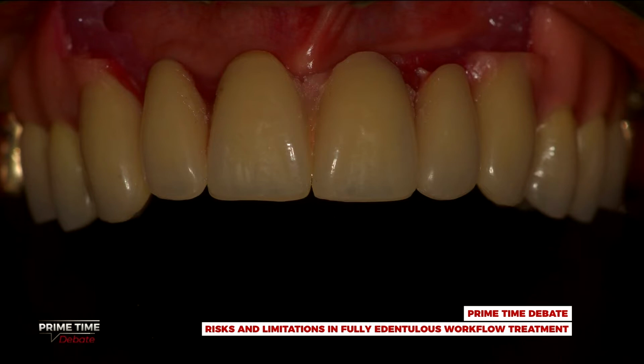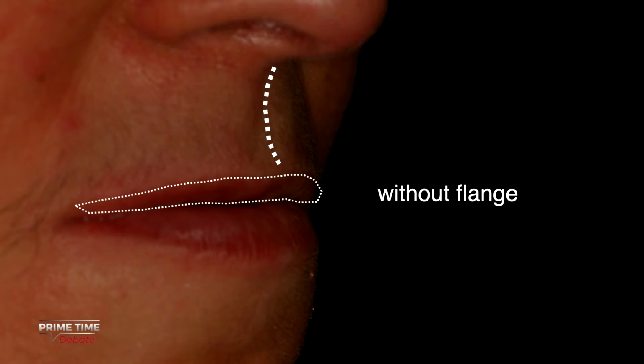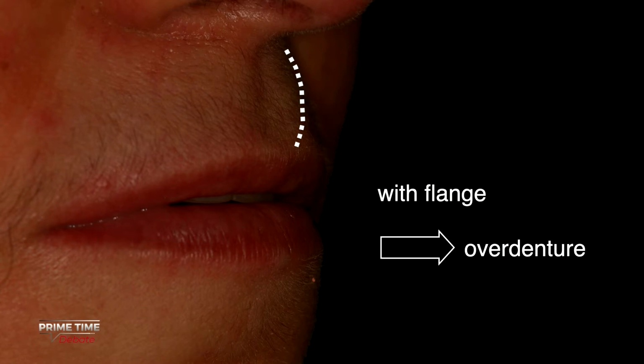If we check this, without the flange, so it means fixed rehabilitation, and we go to the lip, to the facial profile, to tell the truth, I don't like this. The profile is concave, the lip is very thin, so in my opinion it's not the best solution for that specific patient. On the contrary, if we put on the flange, you have a completely different situation, with an appropriately bulky lip and also good thickness. And this means that if I want to obtain the best aesthetic success in that specific patient, I have to perform a removable rehabilitation.